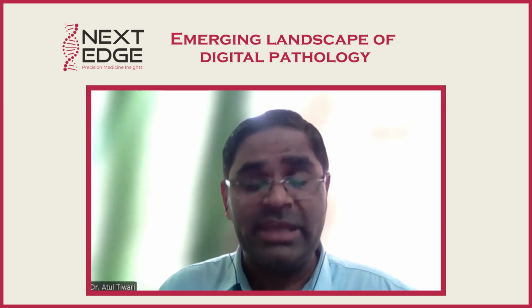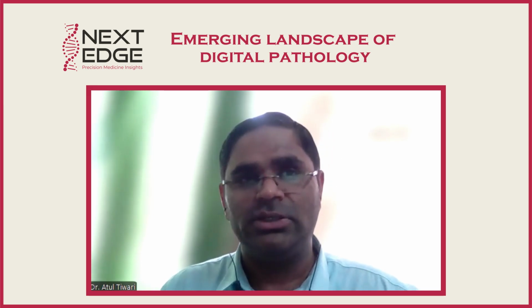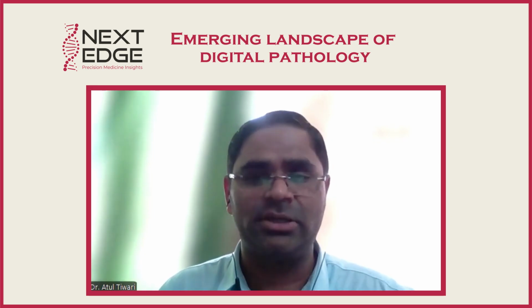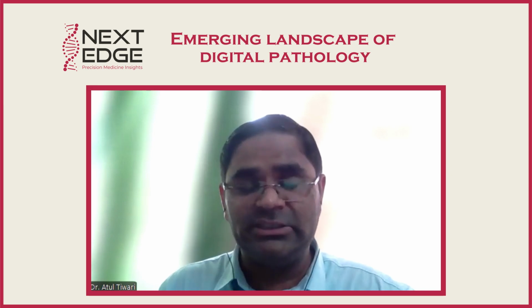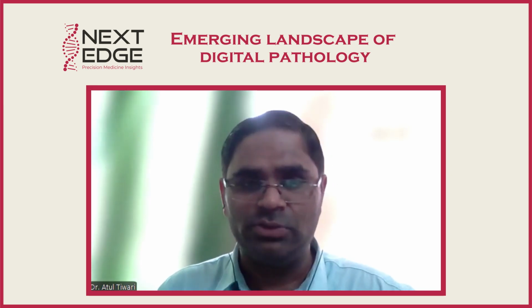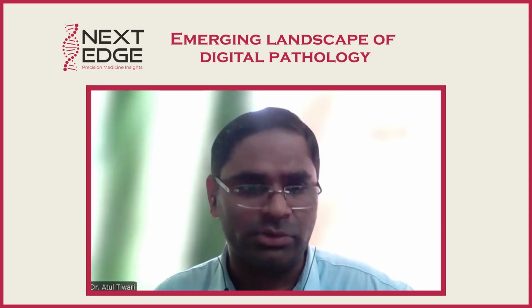Then there can be enhanced collaboration. Suppose I'm working in a small lab, I don't have any other fellow pathologist. If I'm stuck on some case, I want a second opinion. I need to send the glass slide to someone else. But if I have a digital slide, then I can ask one of my friends, whenever you get free, just have a quick second opinion on whether I am on the right track or not.